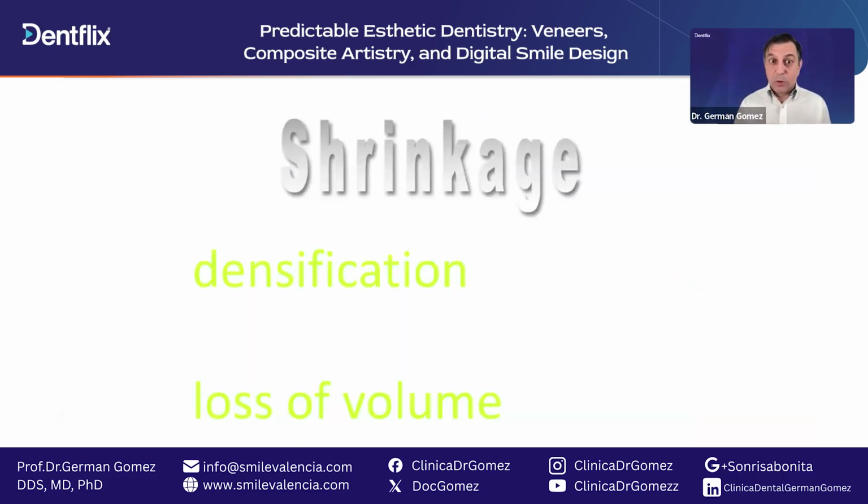Good. Now, a very important thing. Shrinkage and shrinkage stress. Shrinkage is loss of volume, so densification of something. Every composite material and every adhesive shrinks when polymerized, because the polymerization makes the monomers that are not together come together. And this coming together millions of times makes the whole volume shrink.